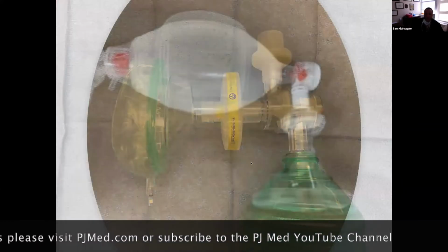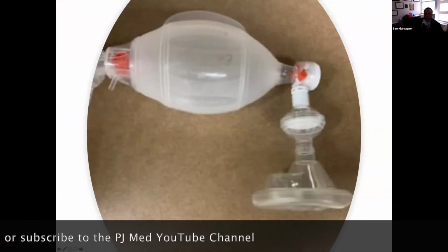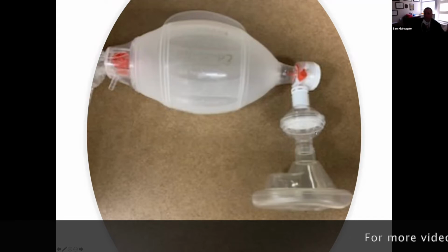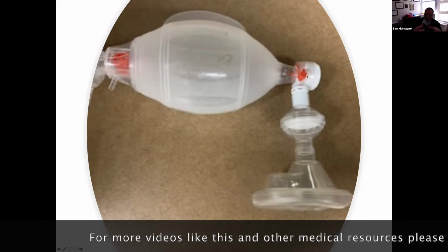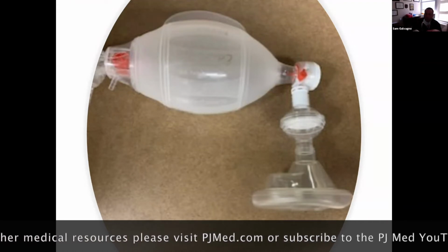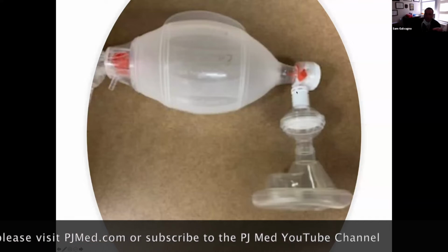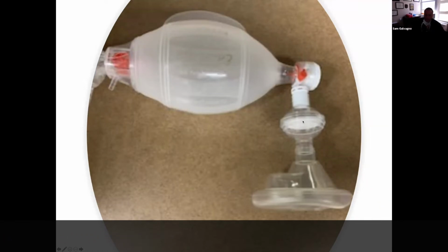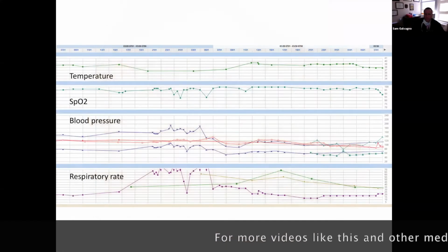Here's the one we actually have here. Sorry, the picture's blurry, but we have just a different type, a proprietary filter. But make sure you're putting that filter on before you tube these patients, because you're going to be bagging them, and while you're not bagging them but you're allowing that oxygen flow to go in, you can wind up with this stuff coming right off the expiratory port through the BVM system. So this will catch those particles and stop it. I think you guys probably already know that. I think you already had some airway talks. I don't want to harp on this anymore unless there's questions.